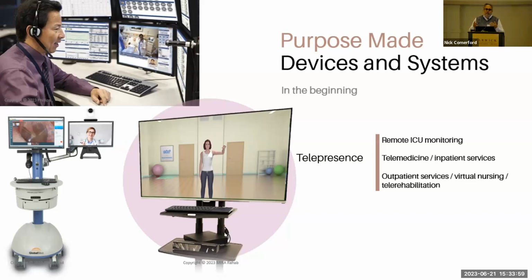And the number one problem when we spoke to the hospitals had to do with the usability of it. Now, this is not the Teladoc cart on there. This is from another company, but they're all pretty similar. It's a cart you have to wheel in, typically in the general care flow, but they're also used in the ICU, and we were adapting them to be used within the OR.